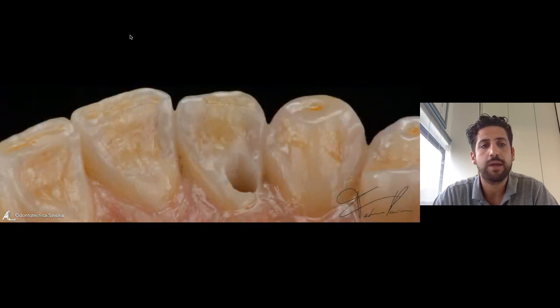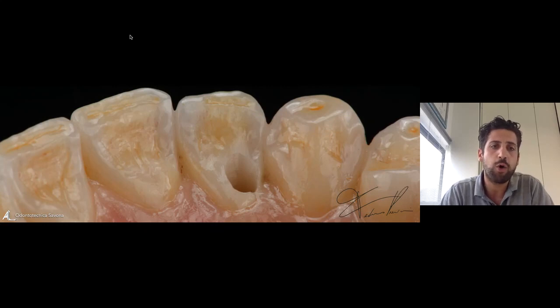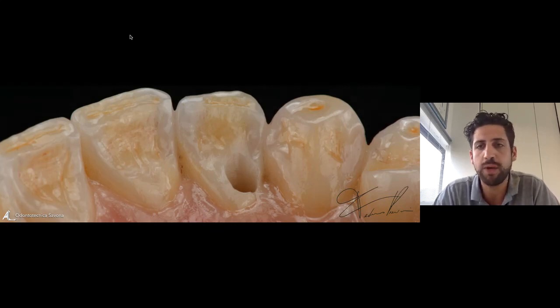Palatal side. It's really important to polish by hand. We're also using some rubber on all the abrasion of the zirconia, to avoid any tension between the full arches and to get a much smoother surface.